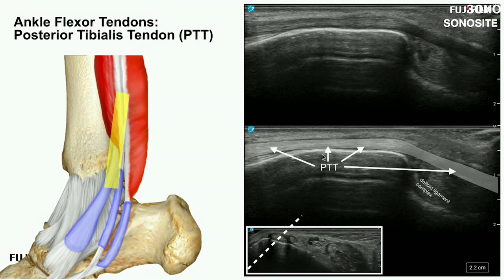Notice the transducer angle — don't go 90 degrees to the skin. Lean the probe handle towards the Achilles. That allows a nice bony backboard of reference. If you take only a 90-degree slice, because of the shape of the tibia, you'll only catch part of the malleolus and the rest of the tendon will be floating in soft tissues. Lean the transducer more towards the Achilles and then fall off the malleolus posteriorly. Deep to the tendon, after it jumps off the malleolus, is part of that deltoid ligament complex.